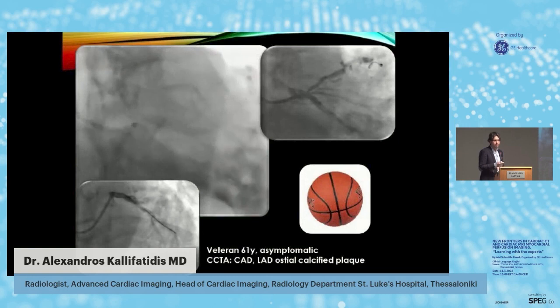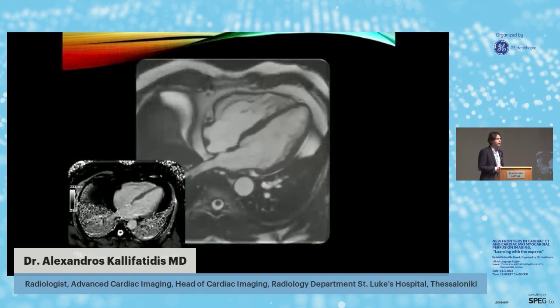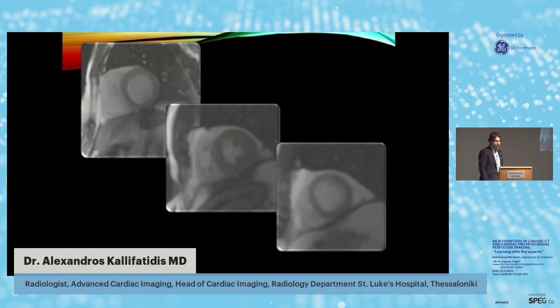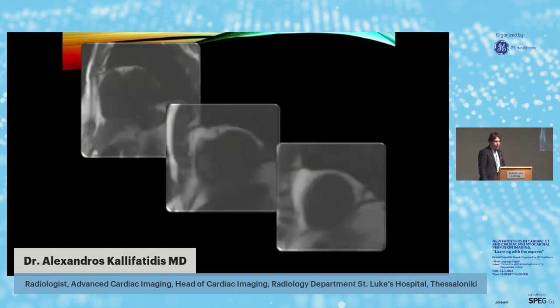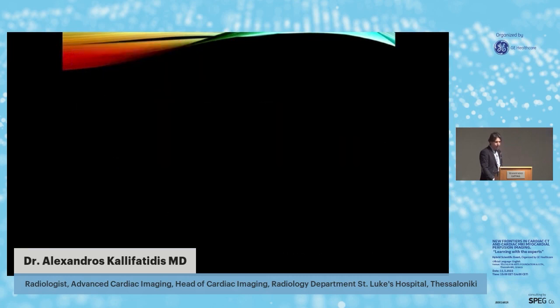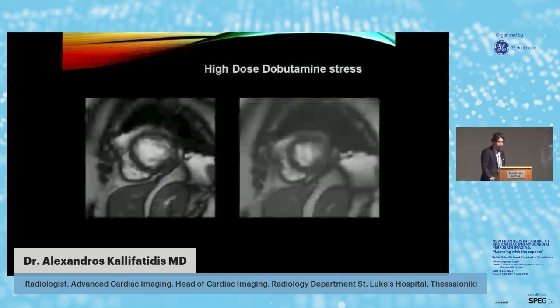So this stenosis was not relevant. This patient had medical therapy, and after 6 months, as a follow-up, we performed a stress MRI. Here, the first cine sequences in 4-chamber view, normal biventricular function, also the T1 mapping here in grayscale, normal values. We proceeded with stress MRI, but during stress we don't see any perfusion abnormality. Maybe we can see this dark rim artifact in the septum, in the mid slice, but no true perfusion defect. So a normal study. Also no delayed enhancement, and with post-contrast T1 mapping we calculated the ECV, the extracellular volume, that was also normal.